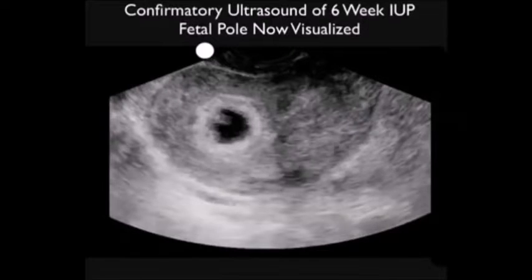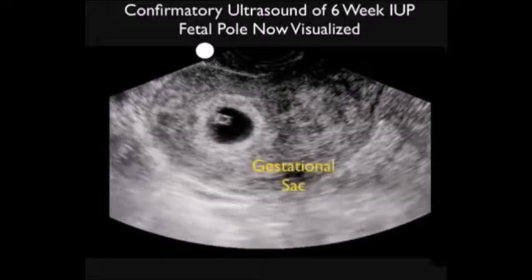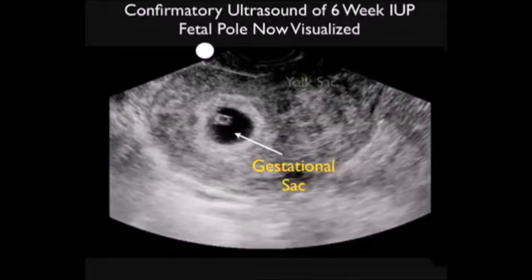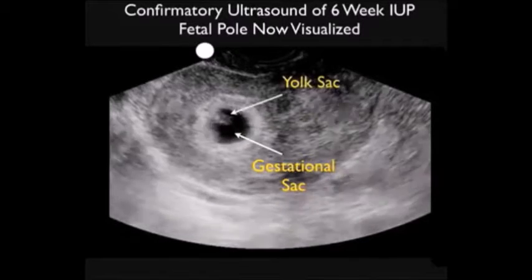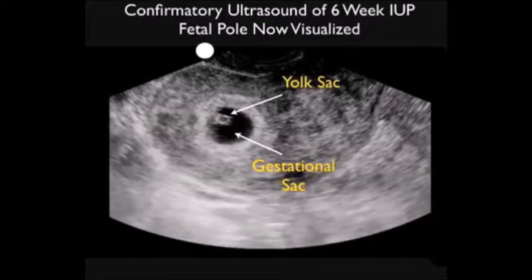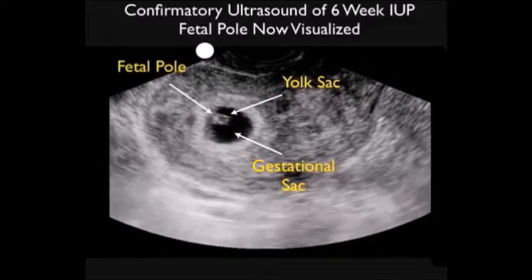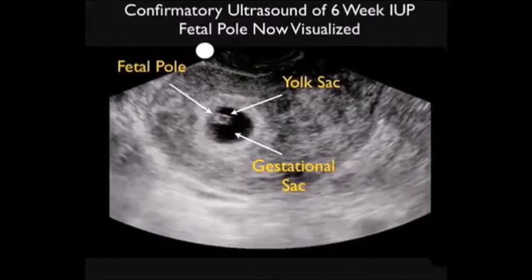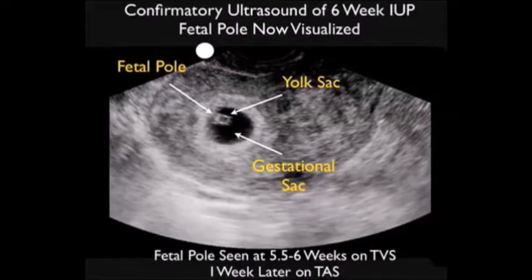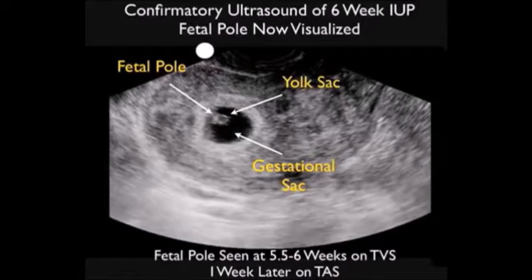Here we see a more advanced pregnancy with a larger gestational sac — the darker hypoechoic area within the fundal region of the uterus. Inside the gestational sac we see the positive yolk sac or cheerio, and just to its left, a tiny fetal pole. Zooming in on the fetal pole, we can make out the flicker of a heartbeat — a definitive intrauterine pregnancy. The fetal pole is seen at about 5.5 to 6 weeks on transvaginal sonography and about a week later on transabdominal sonography.